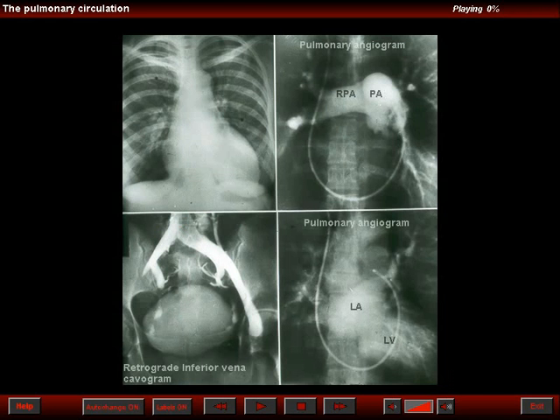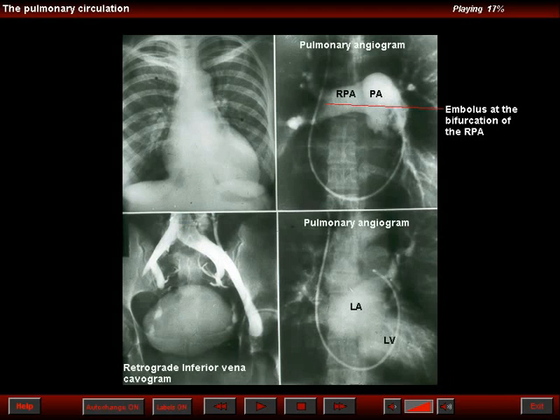The top right image is from a pulmonary angiogram. There were elevated pressures in the pulmonary artery. Note a saddle thrombus in the bifurcation of the right pulmonary artery. This explains the pulmonary oligemia.